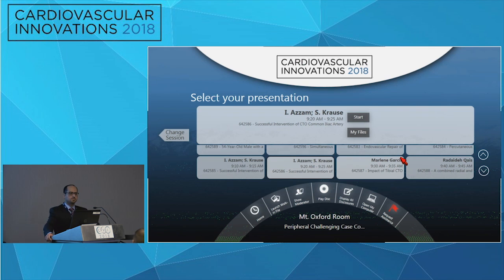I don't necessarily disagree with your use of pedal access, if nothing else, to take that retrograde angiogram with an antegrade angiogram and really understand the lesion. And I suspect at that point you could have potentially gotten ultrasound-guided proximal SFA or distal common femoral and still had a little bit of running room with a 7 French sheath to have bailout options. I think that's a really important lesson we all need to be aware of.